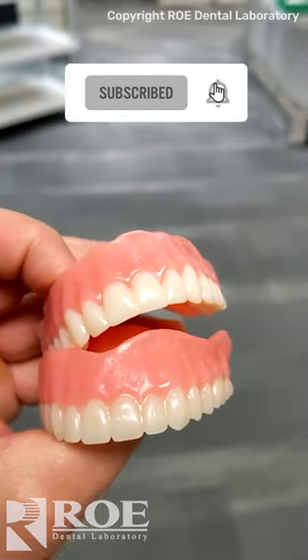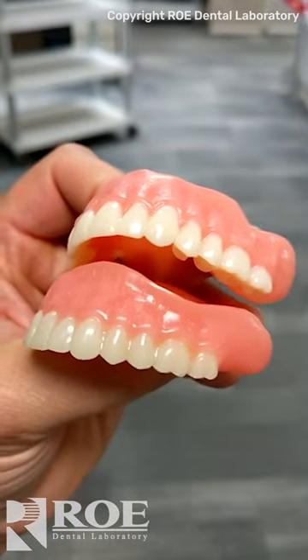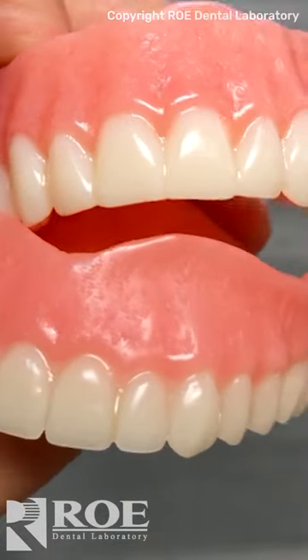How do you tell the difference between a milled iVotion denture and a printed Lucitone denture? I mean, you really couldn't tell by just looking at these dentures. How do you tell?